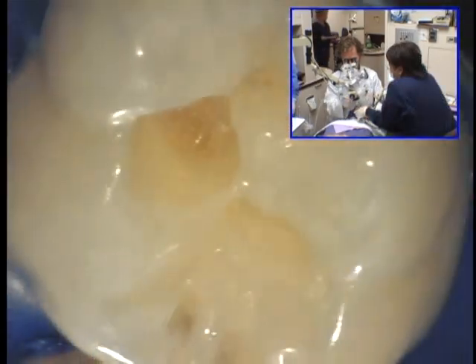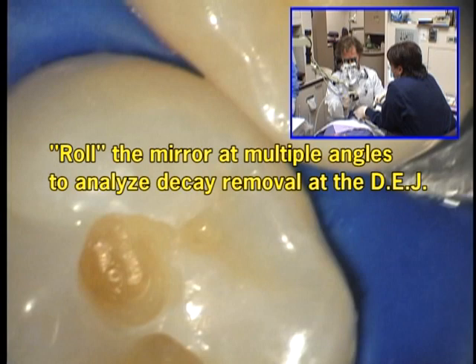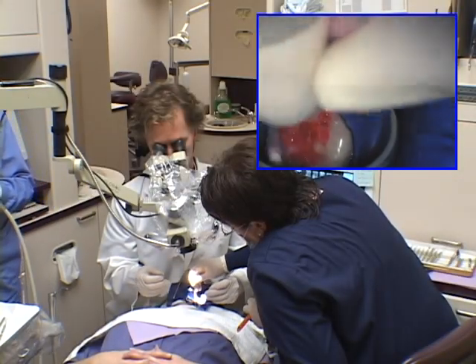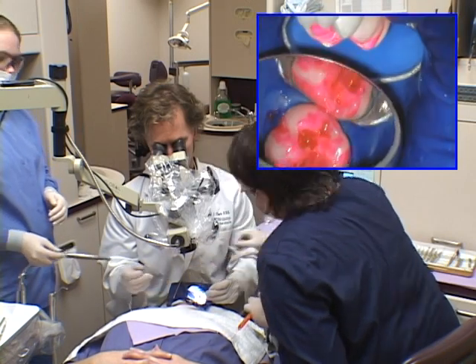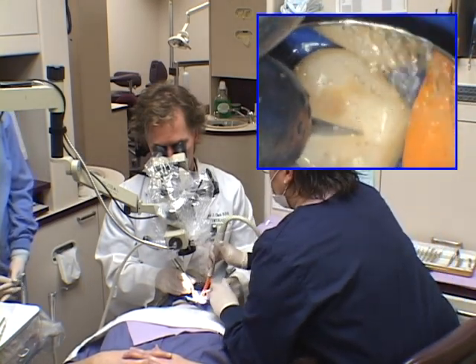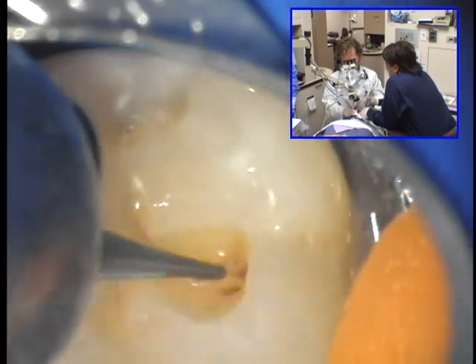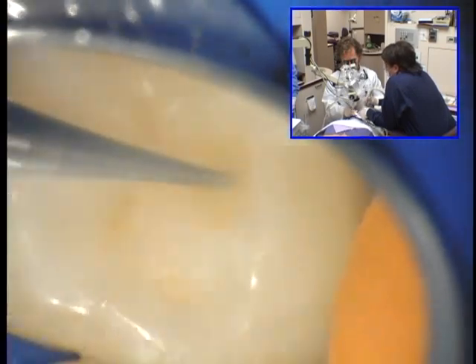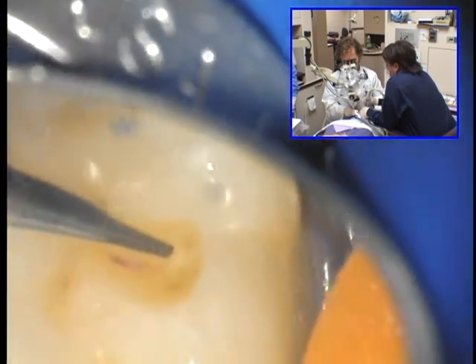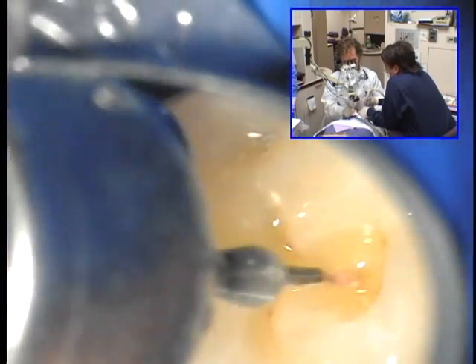One of the critical diagnostic keys in advanced magnification is to roll the mirror at multiple angles. This is as important in endodontics as it is in restorative dentistry — finding decay is much like finding canal systems. Instead of removing dentinal caries with the large slow-speed round burr, I find it more conservative to use a 1/16th round burr at high speed. With the use of the microscope, we see that decay penetration is often uneven and follows the DEJ. This approach creates a more conservative cavity preparation, and the irregular surface provides better retention and resistance to micro-leakage.